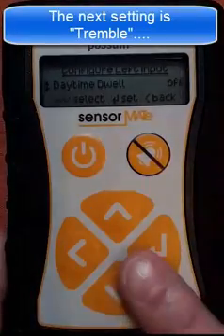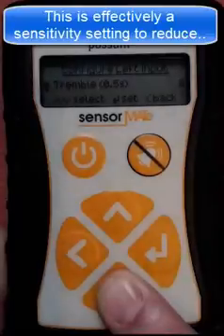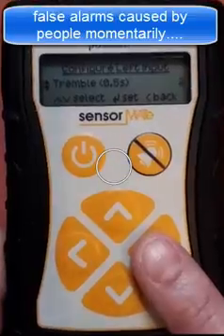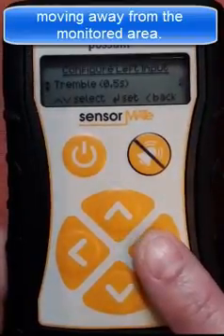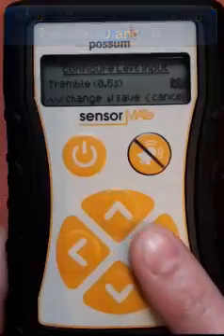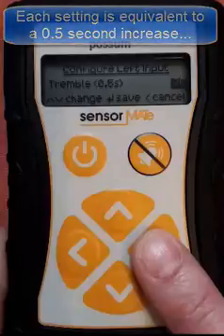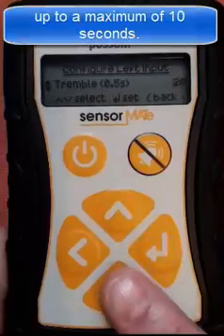The next adjustment setting is the Tremble facility. This is effectively a sensitivity setting to reduce the amount of false alarms caused by people momentarily moving away from the monitored area. This adjustment can be configured to anywhere between 0 and 20. Each setting is equivalent to a 0.5 second increase, so a setting of 20 equals a maximum of 10 seconds.